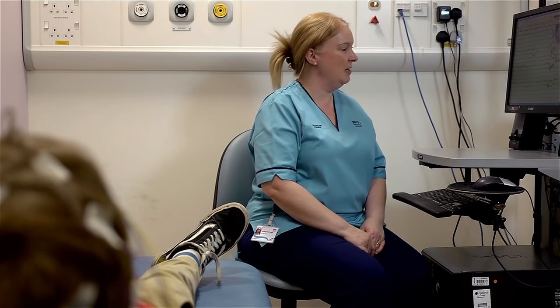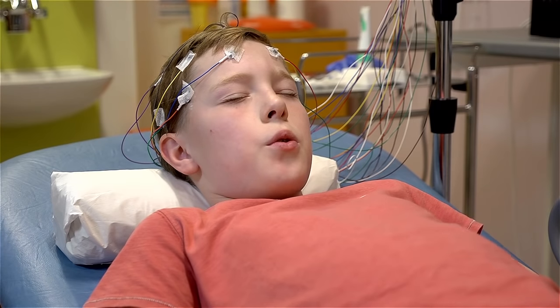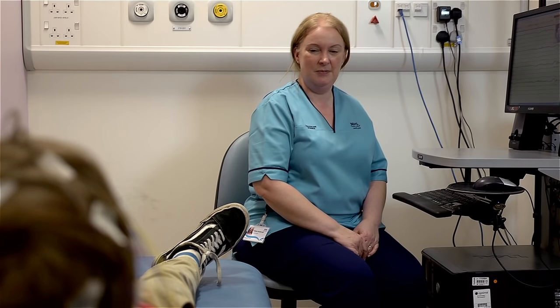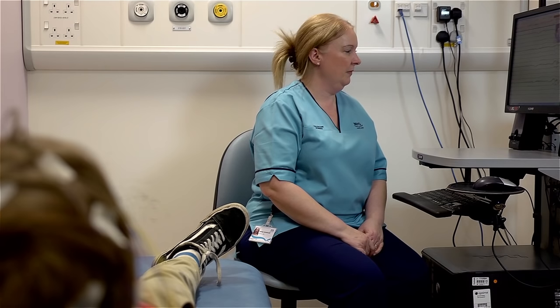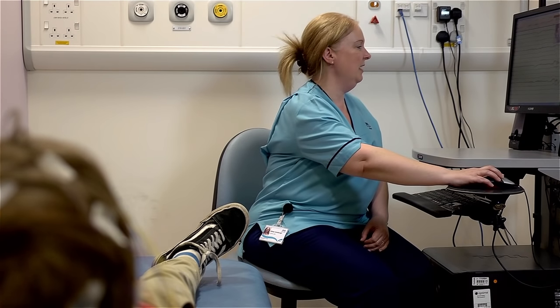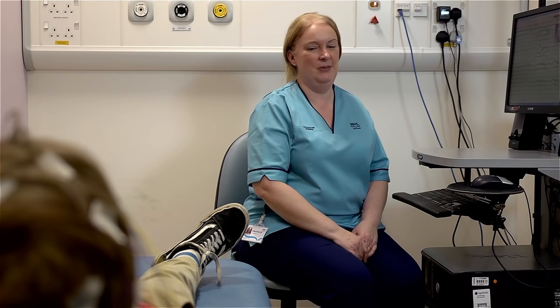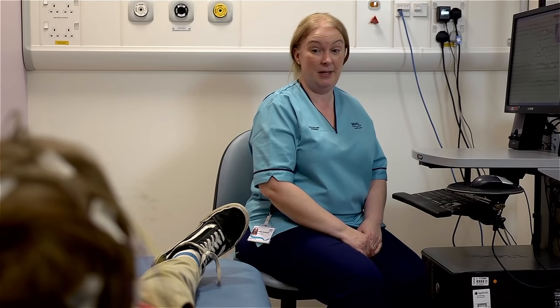That's fantastic, just keep going. You can stop now and just keep your eyes closed. And I'll get you to open your eyes again. How do you feel after doing that? A bit dizzy. That's quite normal.